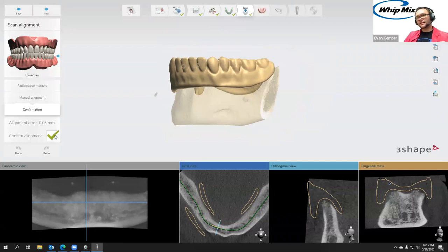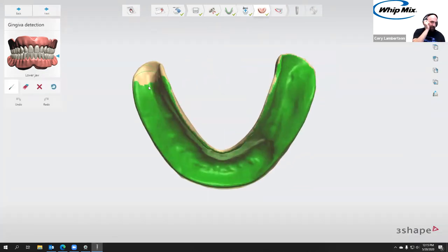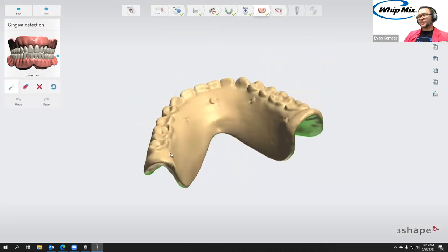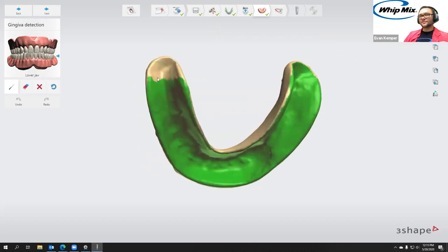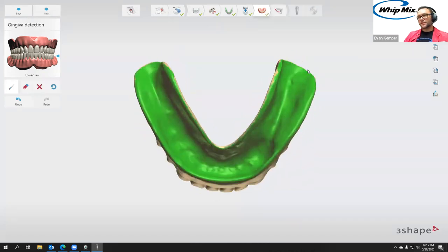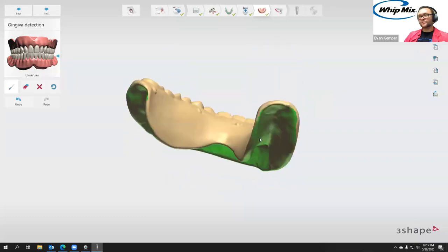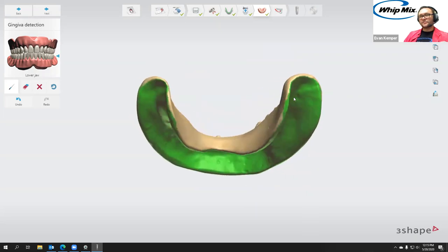The alignment error on that previous stage was only 30 microns — which is even more accurate, technically, than when it's doing the surface scan to the cone beam. Here I am selecting the surface that I want the software to regard as the soft tissue. You can see it auto-detected it pretty well, and I'm just left-clicking to add a little bit more. That looks good, so then I'm going to go next.